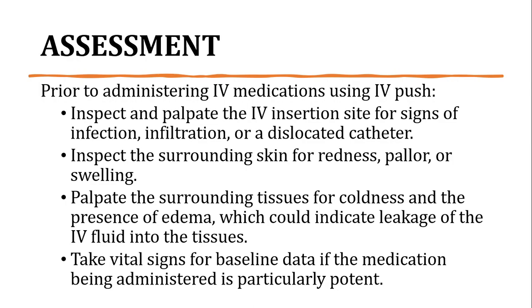Kapag nakita yung signs nitong mga naka-indicate dito such as infection, infiltration, or a dislocated catheter, kailangan po i-replace or ilagay ulit yung IV lock or the intravenous site sa client, kasi po kapag ganyan, meaning hindi nalagay ng maayos or na-misplace yung IV sa client.